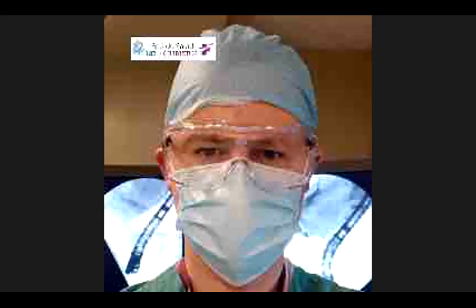So let me ask Alberto, do you use bipolar catheter? Yes, good morning, everyone. Yes, I'm using bipolar with good results. Obviously, very gentle on the base of the submucosa.